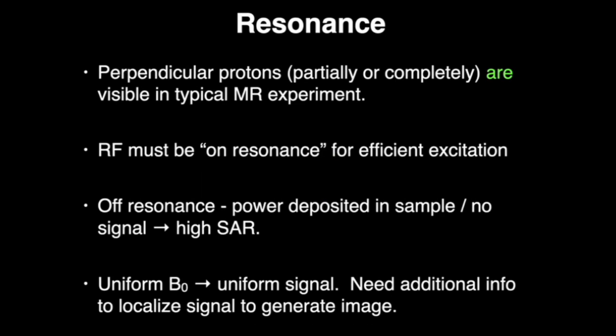This is just recapping what we were saying. You need to knock or excite your protons out of parallel alignment into perpendicular orientation so we can detect it. You need to be on resonance. You need to match those frequencies to do it efficiently. If you don't, you're putting energy into your subject or sample and heating them up. This can cause what we call SAR issues. That's wasting energy, and it's potentially dangerous.